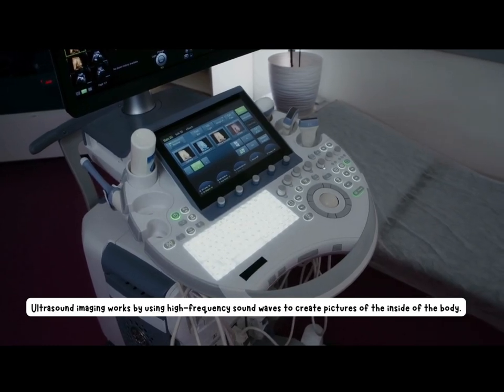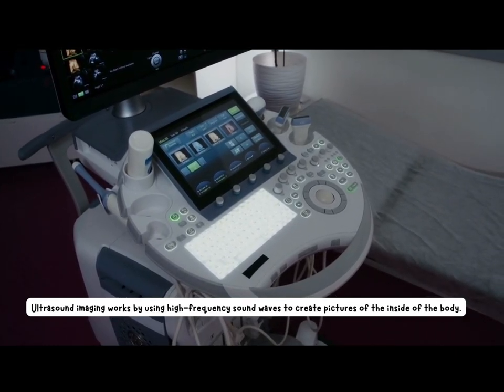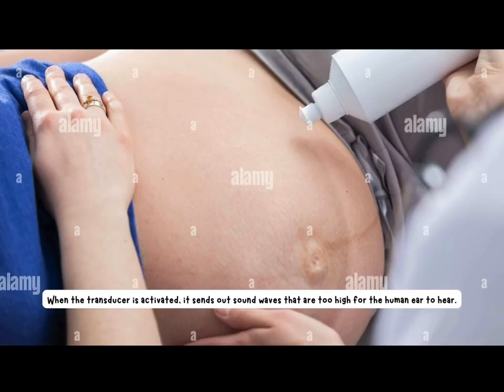Ultrasound imaging works by using high-frequency sound waves to create pictures of the inside of the body. It begins with a device called a transducer, which is placed on the skin after applying a special gel. This gel helps remove air between the probe and the skin so that sound waves can enter the body smoothly. When the transducer is activated, it sends out sound waves that are too high for the human ear to hear.